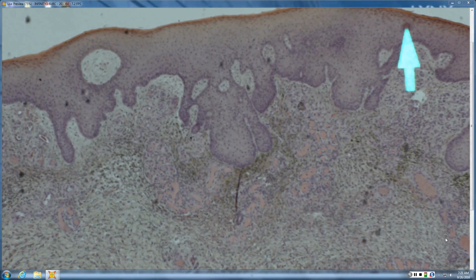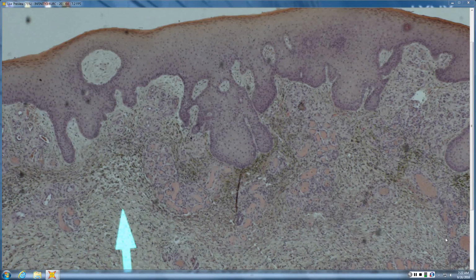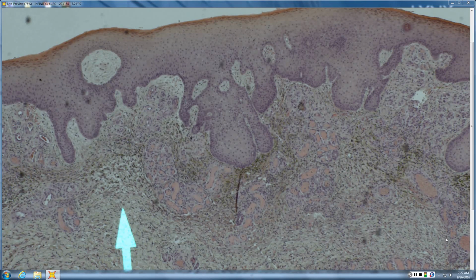And so again, a little closer, you see confluent, compact horn, not really tons of neutrophils, but if it's secondarily impetiginized, certainly you could see that. Acanthosis. And then all this is hemosiderin, so it's not melanin. If it's a darker skinned person, you certainly can get PIH in those areas, so there might actually be true melanin as well. But in this case, all this is that hemosiderin, which is giving it that cayenne pepper look or stasis dermatitis look. Sorry, I use cayenne pepper, that's more Schamberg's, which is technically a PPD, but similar in the sense that it's hemosiderin and producing that color change that you notice clinically.